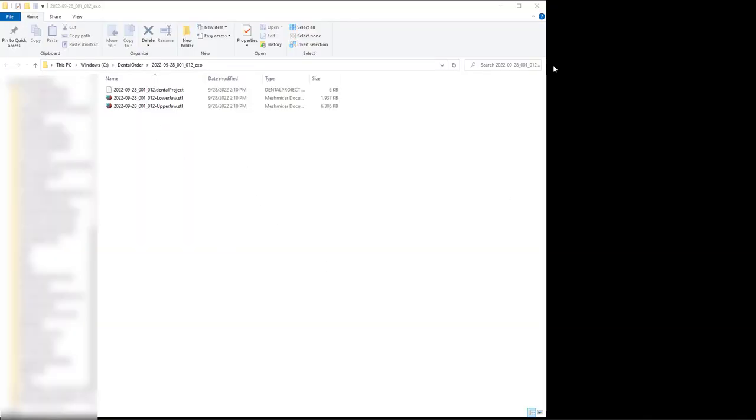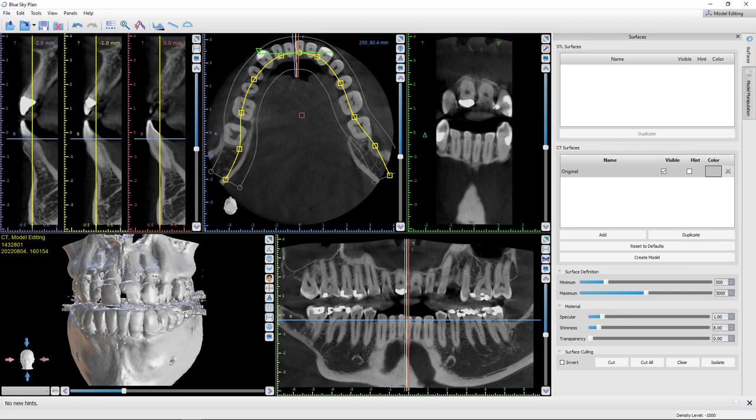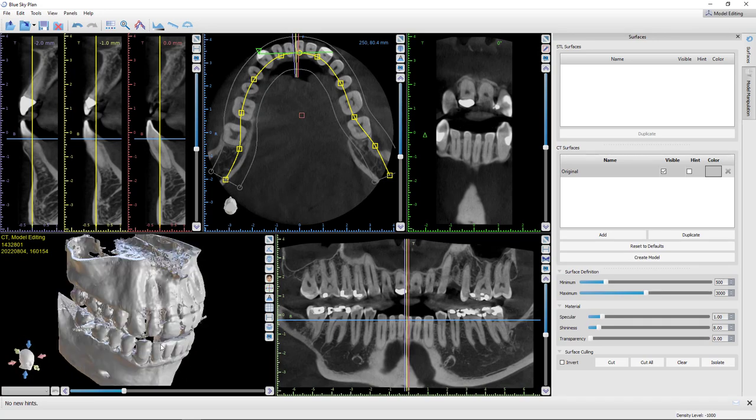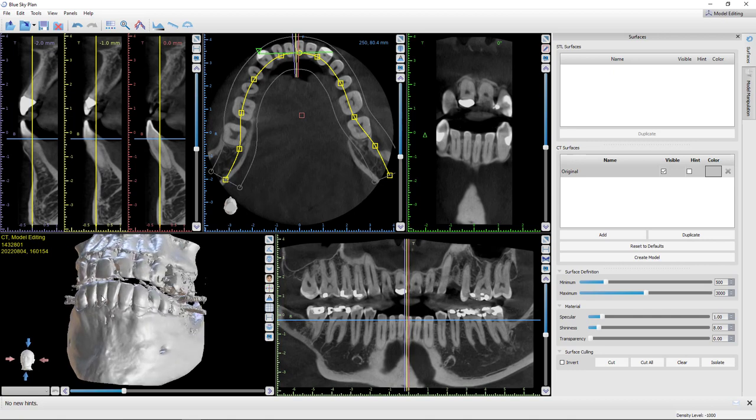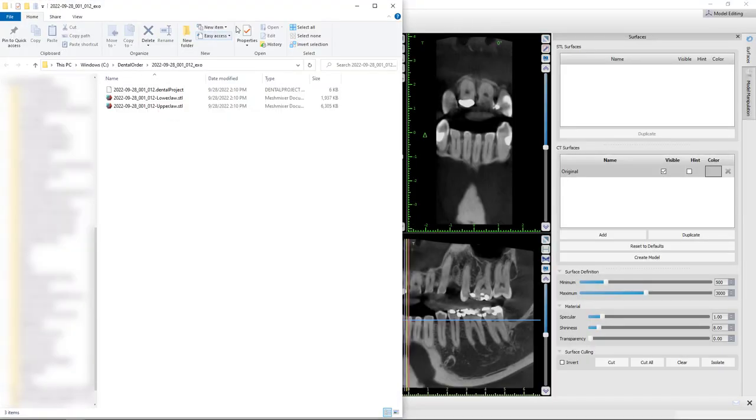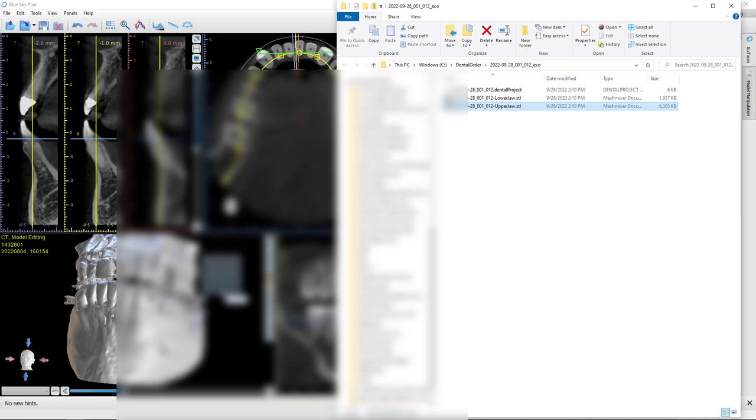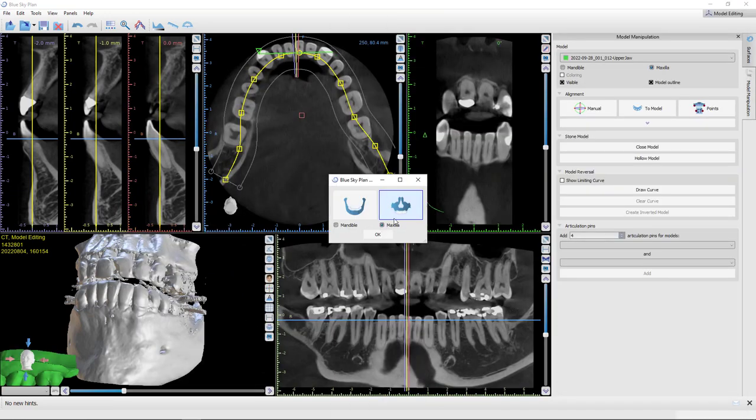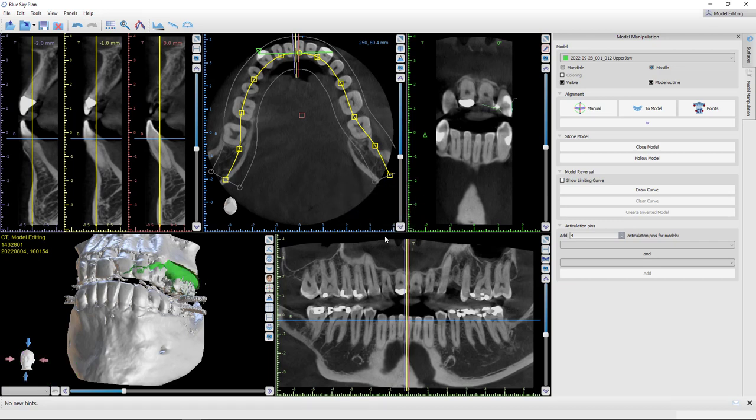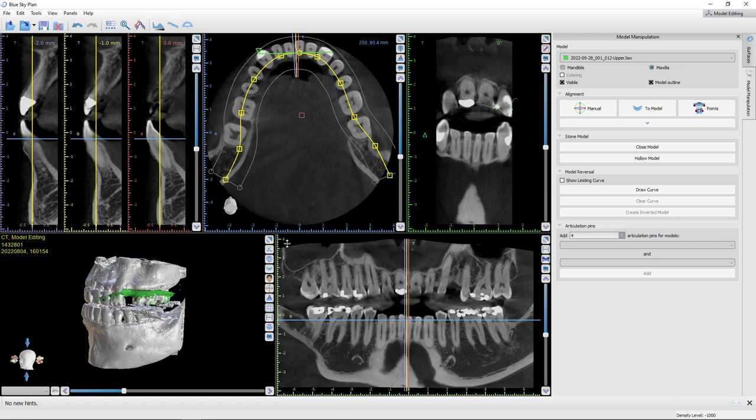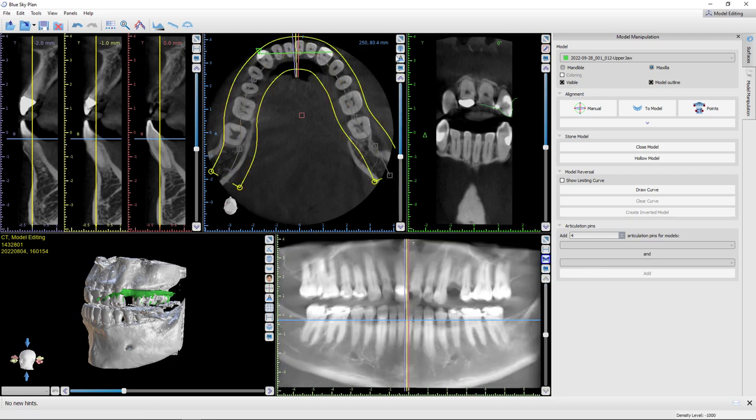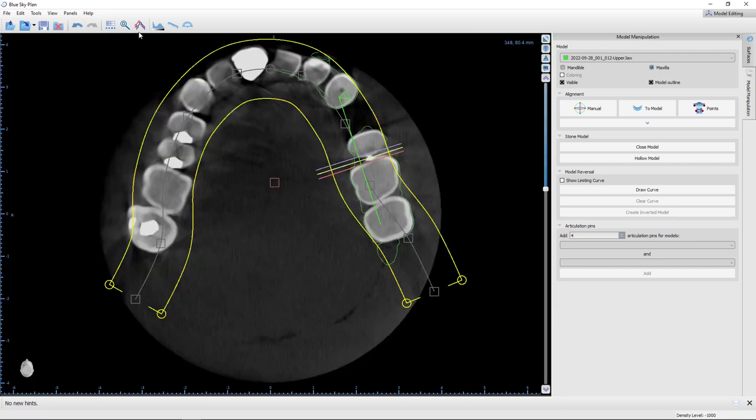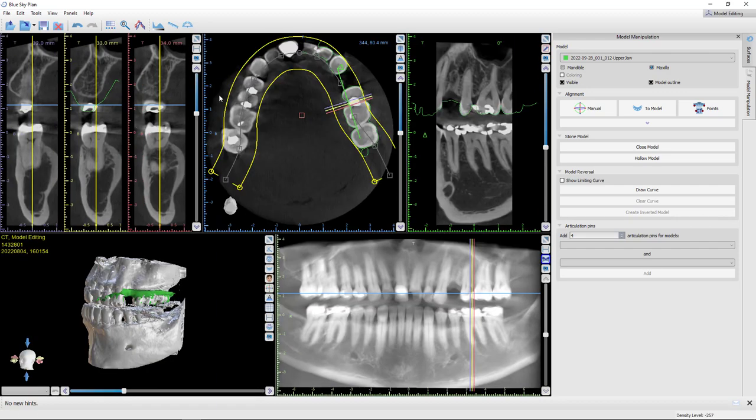Okay. So now we have taken our scan. We've got the folder open with those two STL models in them. And I've also gone ahead and opened this patient's cone beam data in Blue Sky Plan. So here you can see we've not done anything yet. We've just simply opened the data. All right. So the first step we're going to do is just grabbing that STL. I'm going to do the upper first. So I'm just going to drag and drop in here. Now it's going to ask me, is this a maxilla or a mandible? So I'm going to tell it a maxilla and this generally is going to auto stitch. However, I'm skeptical it will in this case because this is only a quadrant impression. The auto stitch function works amazing when you have a full arch. But sometimes if you've only done a partial arch, you might not get a great stitch and you might have to do it manually, which is not the end of the world. But having said that, actually, this kind of surprises me. We appear to have gotten a great stitch here. So that's good news.